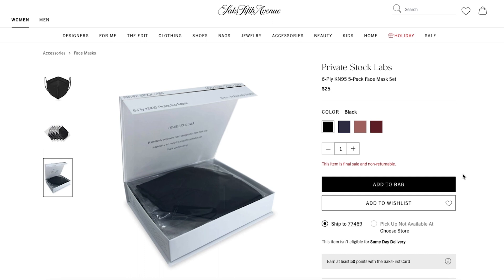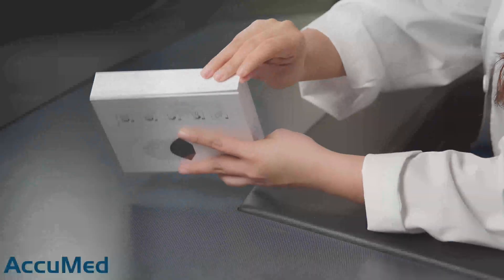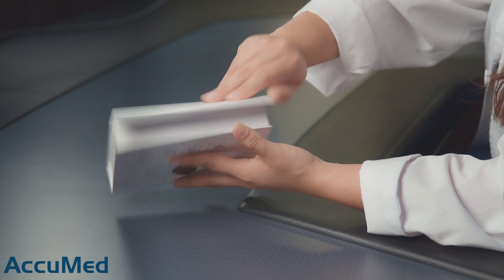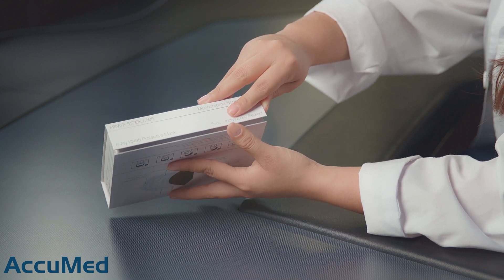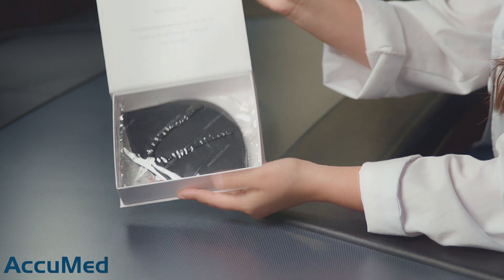Going back to the listing, these do cost $25. The website doesn't really have any reviews, and one thing I didn't find on their listing or on their packaging is the GB2626 standard number, so I don't know what standard they follow. The packaging is very nice — they come in a magnetic box and also come individually wrapped.